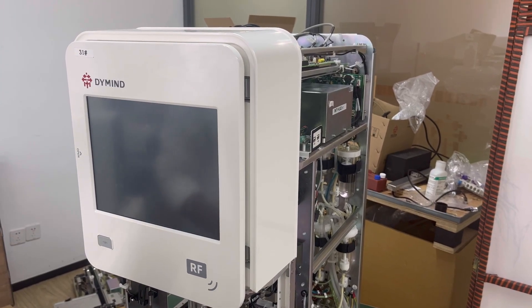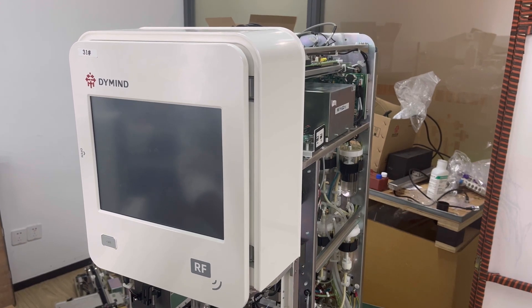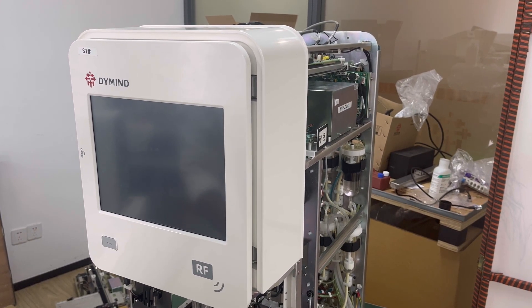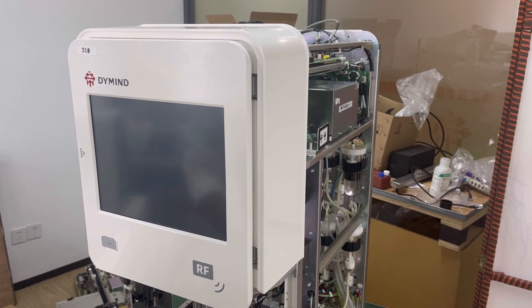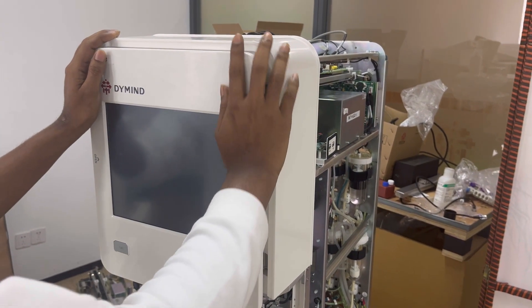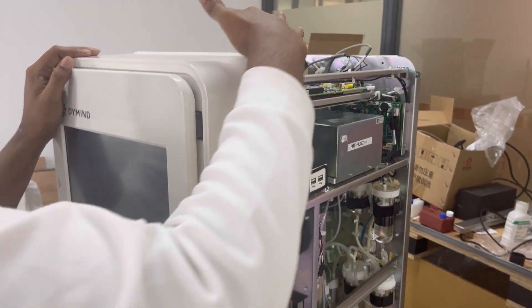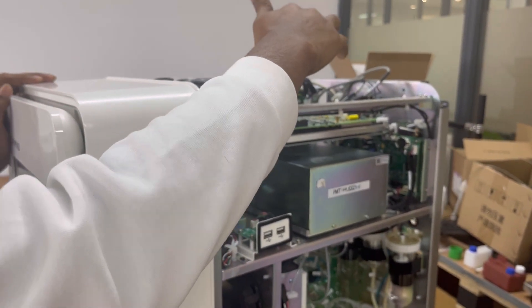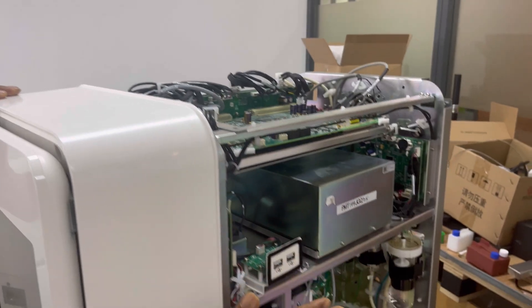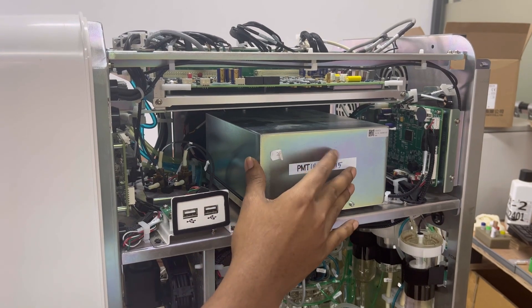Hello everyone, I would like to show you how to disassemble and assemble the optical unit of the DH615 analyzer. Let's have a look at the position of the optical unit — it is on the right side. Before disassembly, we need to remove the top cover, left side cover, and then the right side cover.